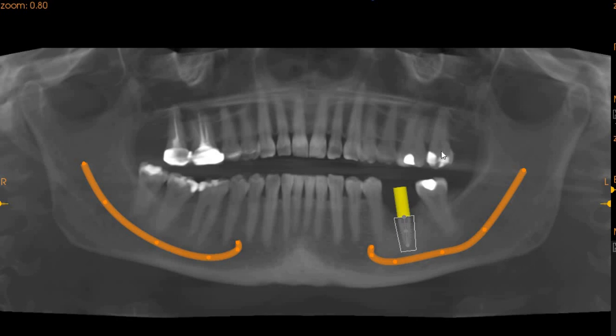This is how the implant looks on the panoramic view. This is a 4.1mm diameter with a 10mm length. 10mm should be ideal because anything longer will invade the inferior alveolar canal.